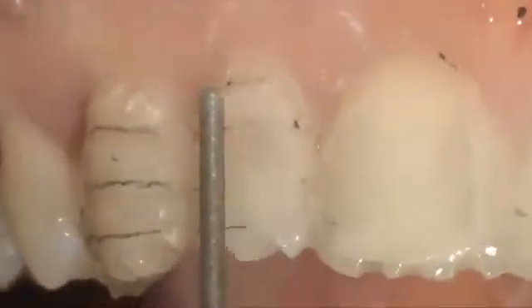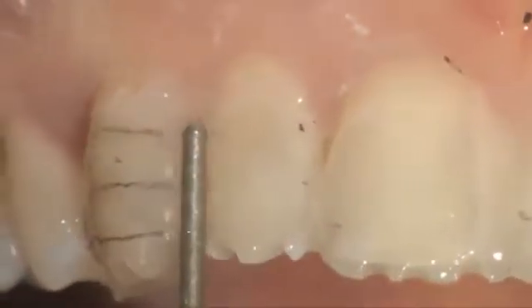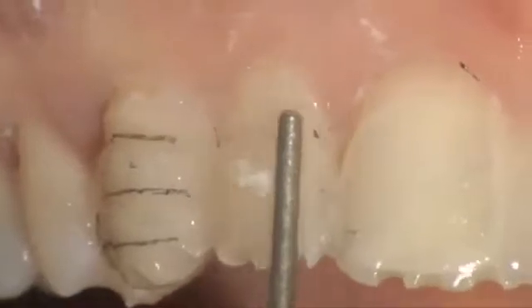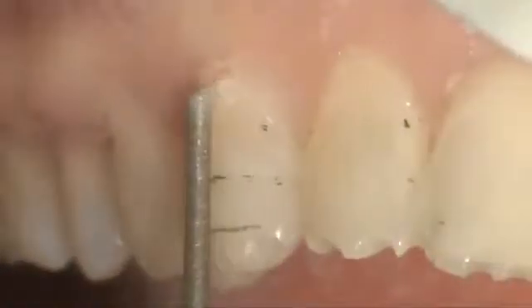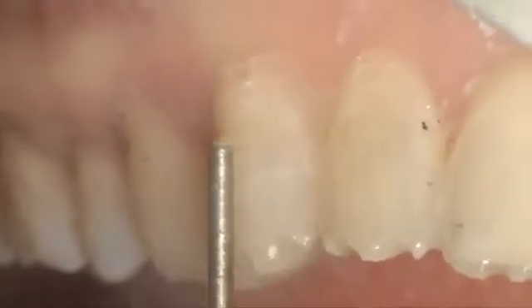As you can see, drawing some lines to the bottom of the deep cuts is useful to drive the axial preparation, avoiding grinding away healthy enamel, essential for the adhesion and longevity of the final restoration.